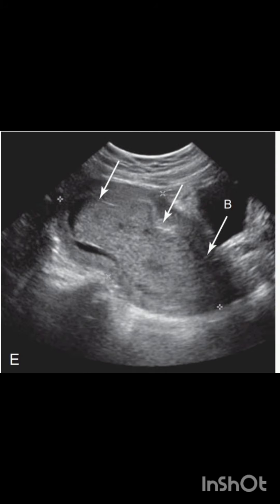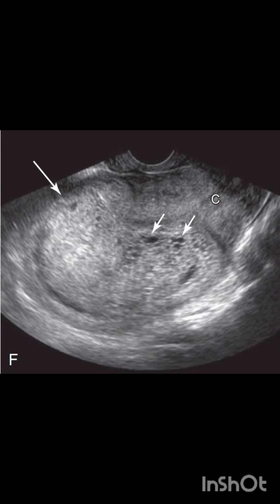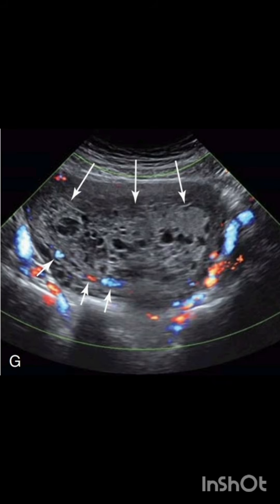This image shows a solid-appearing mass that occupies the uterine cavity, which is difficult to characterize on a transabdominal scan. When a transvaginal scan was done on the same patient, smaller cysts that were initially not visible on the transabdominal scan became apparent, confirming that it is a molar pregnancy.